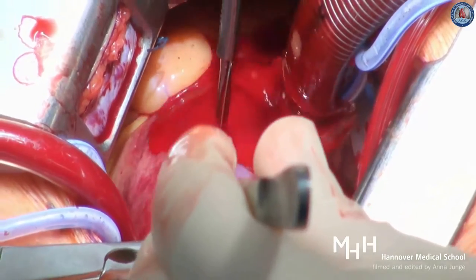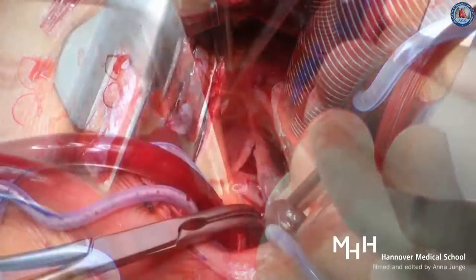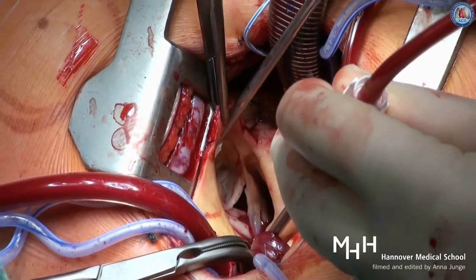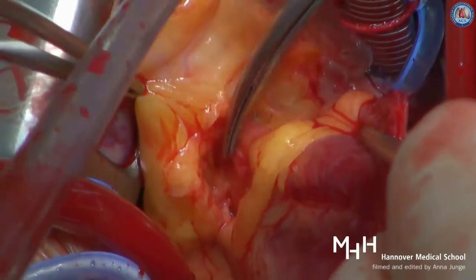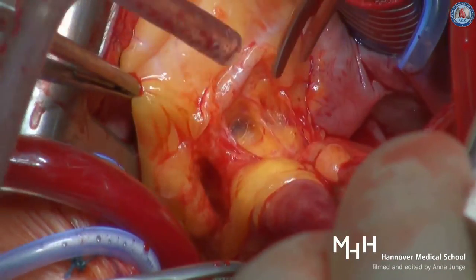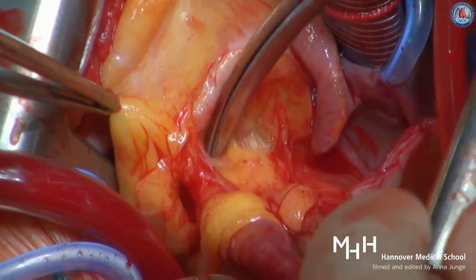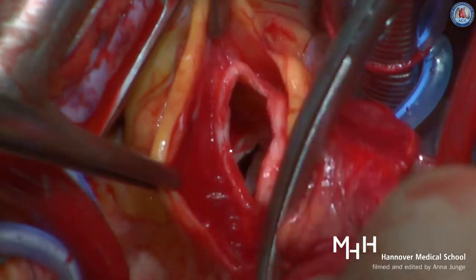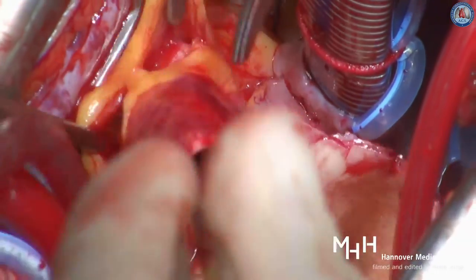The aorta is cross-clamped and opened. Cardioplegia is given selectively through both coronary ostia. Cold blood cardioplegia is our preferred method of myocardial protection during David procedures. Cardioplegia is repeated every 30 minutes.